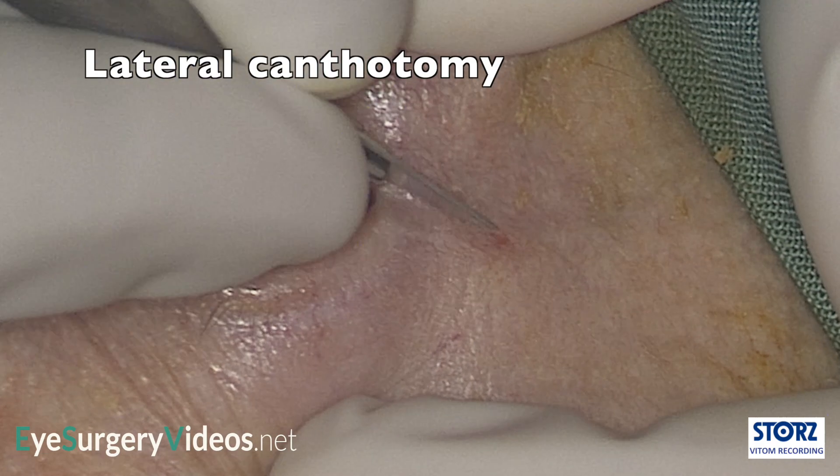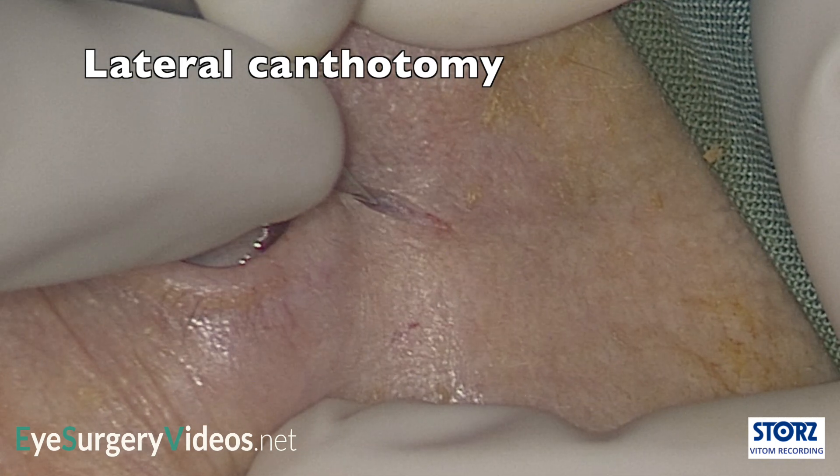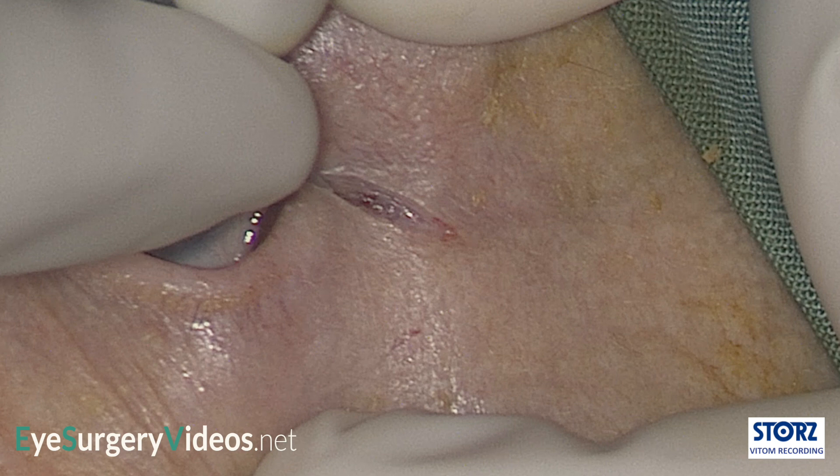The patient is likely to be under general anaesthetic, but local anaesthetic may also be infiltrated to the lateral canthus and lower lid to improve haemostasis. The use of a corneal shield should also be considered.